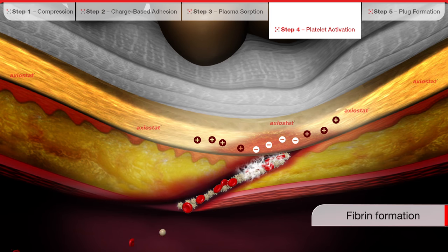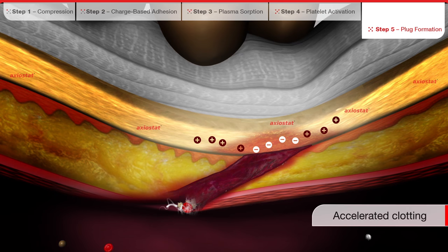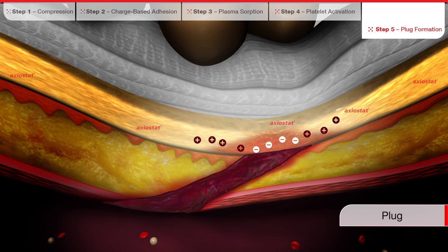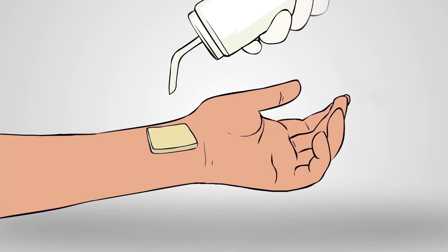This pathway eventually results in fibrin formation and creates a plug that extends throughout the site of the injury, thereby stopping the bleeding. Once hemostasis is achieved, compression is removed. The wound remains closed due to the fibrin mesh and there is no further bleeding.